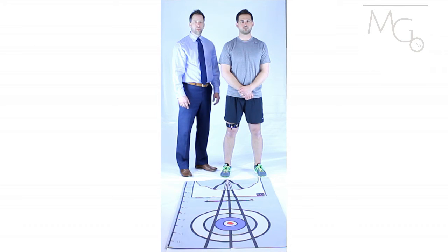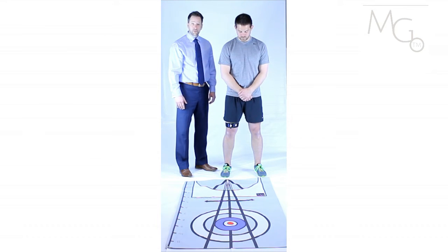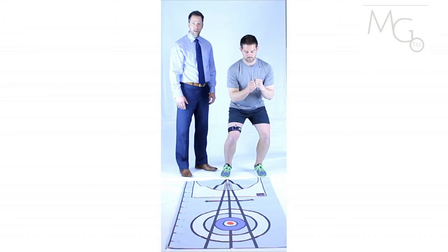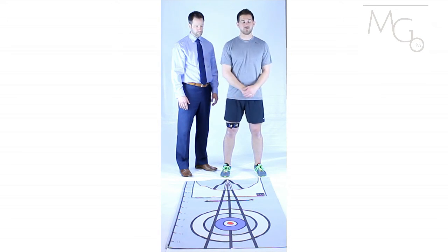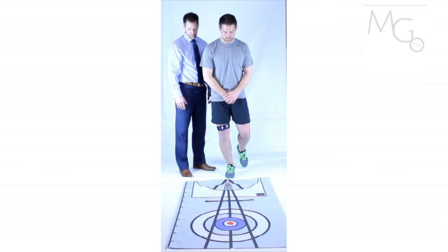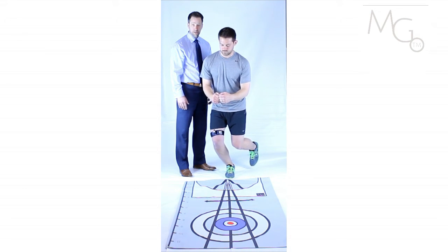As an advanced application, the patient can start doing varus and valgus reversals while in a double or single limb squat to challenge range of motion, body awareness, and motor control. The patient turns on the laser and places it in front of the big toe. They then go through a squat, move the laser to the left into valgus, to the right for varus, back to the middle, and then up. We can then do this in single leg stance — squatting to the left, to the right, back to the middle, and then up.